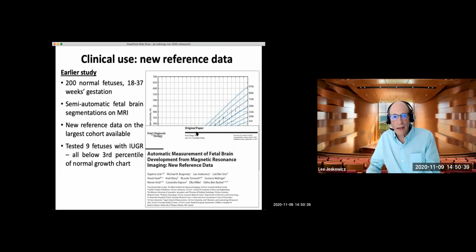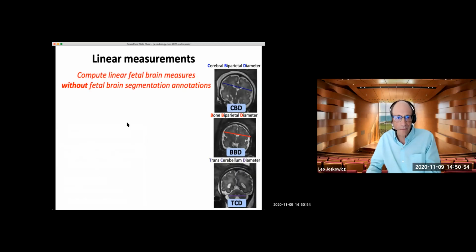We published this development curves from MRI, and now we're in the process of extending these development curves to 500 fetuses with the network that we have just trained. Okay.